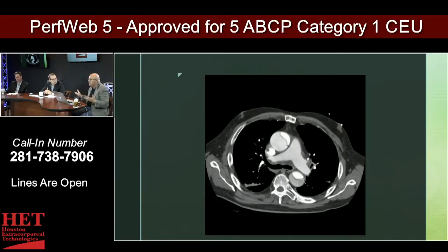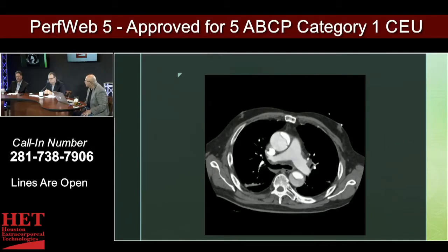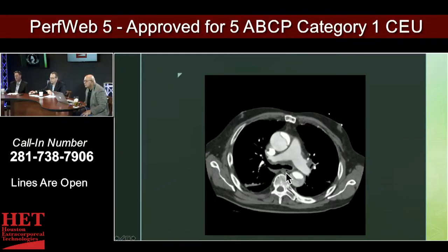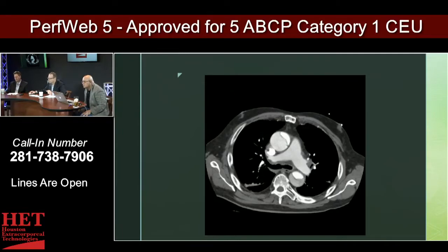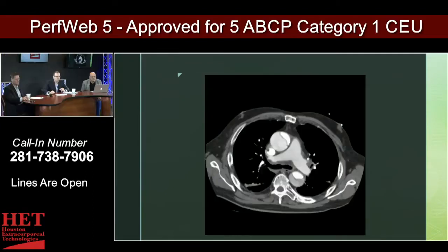What's so interesting to me is how close these structures are to each other. And you can see how this is a good illustration of the efficacy and utility of a transesophageal probe, because this is the esophagus right here — that's the little small amount of air within the muscular esophagus. So if you have an echo probe there, all this anatomy you could see.